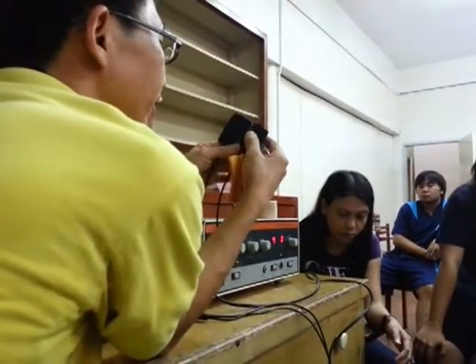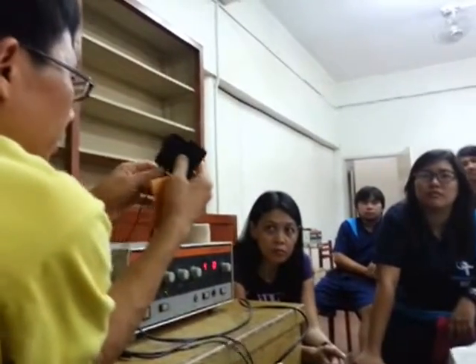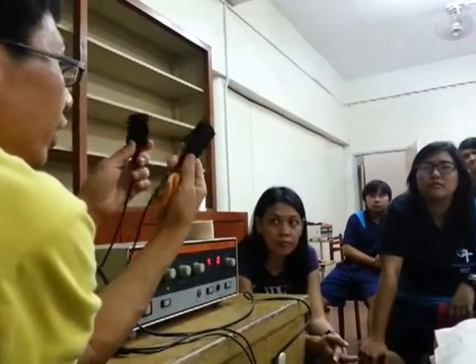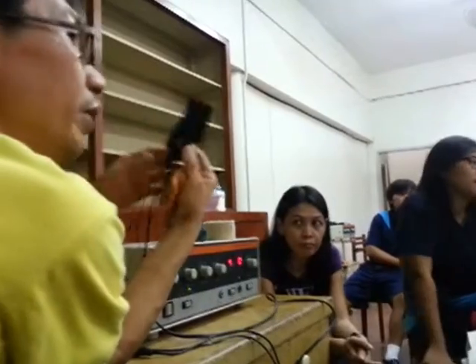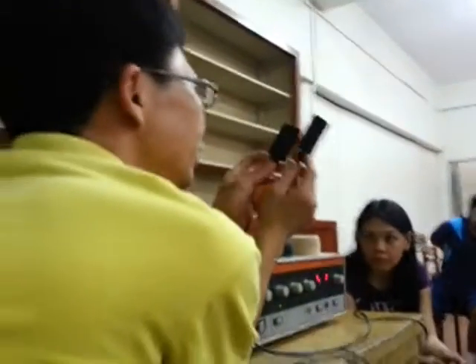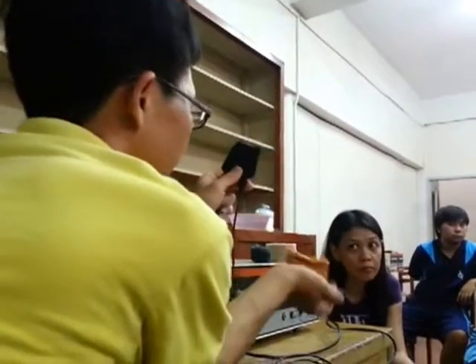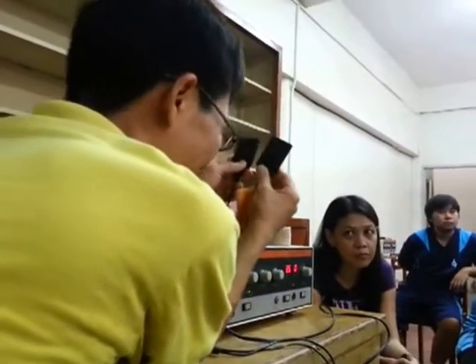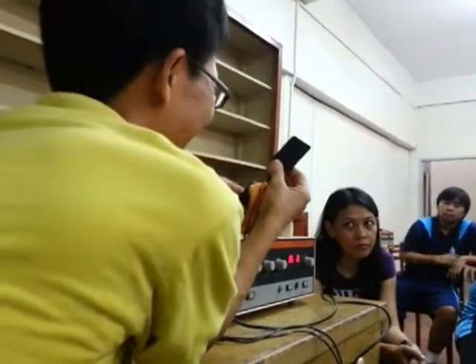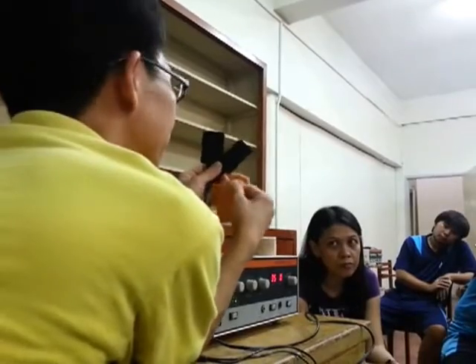Here, in order for the current to be transmitted, you need a certain medium. You can apply gel, but the problem with gel is that it's expensive. With regards to this electrode size, we can use the gel but we don't. We just use water as the medium.